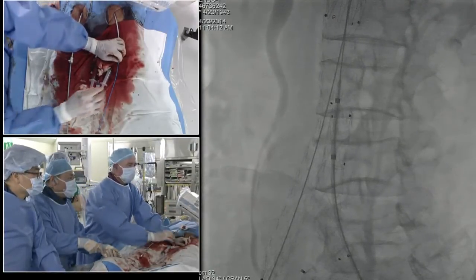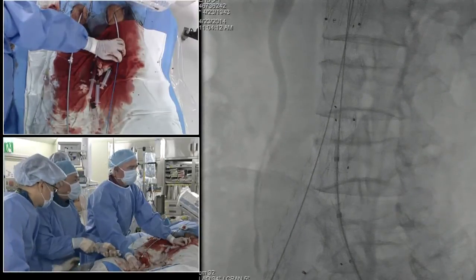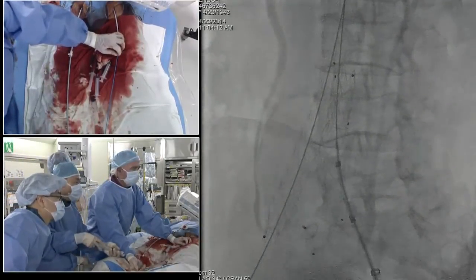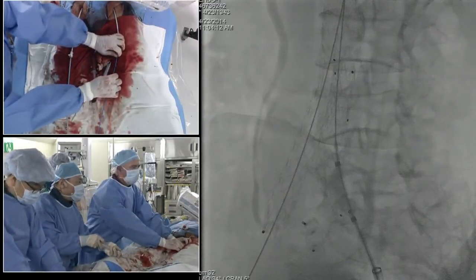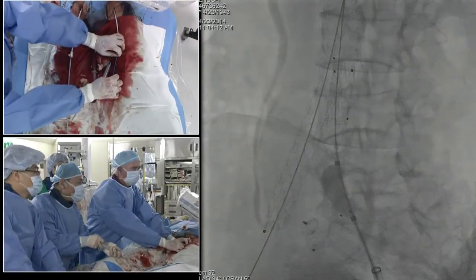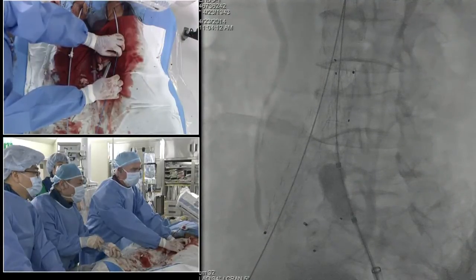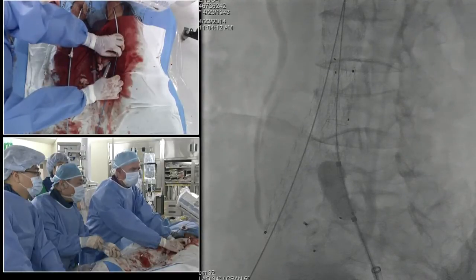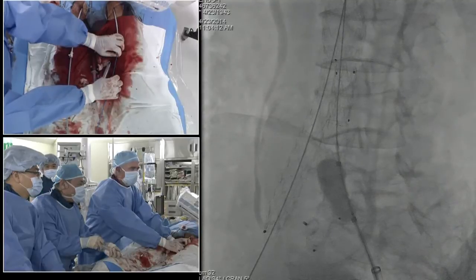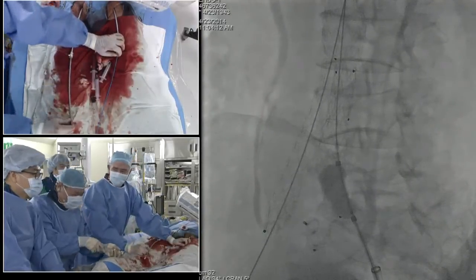And we'll be a little bit more aggressive here down at the distal edge with our balloon. I'm going to have it stick out just a hair. We normally don't like to stick out there, but you're going to have to. I think we've got to fan it out just the tiniest little bit. Dr. Herr's going very slowly here, but we'll go up just a little bit more. A little bit more, you got it. If there's a problem, then I can blame it on Dr. Herr. That's right. Okay, come on down.